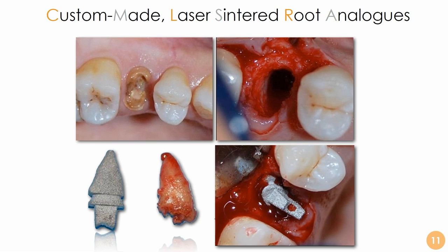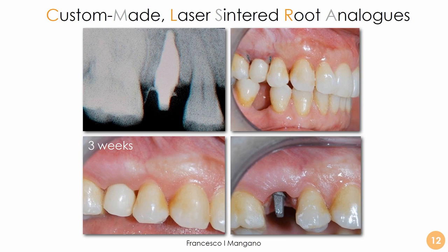conservative. This case was performed by Professor Figliuzzi, and it was very delicate because you need to care about the periodontium very much, you need to care about the existing structure, because if the extraction is traumatic, then the implant will not fit perfectly. But if the extraction is totally atraumatic, like in this case, then we will have a perfect congruence of the implant within the post-extraction socket.